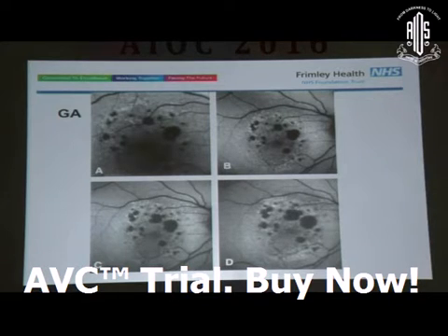We have the lampalizumab trial, the Chroma and Spectri studies, which actually depend on fundus autofluorescence to decide whether the patients are eligible. Because with the geographic atrophy trials, what you're trying to do is look at the progression and stop the progression of the disease. Similarly, you have trials using brimonidine implants, again doing the same thing. And both these trials are looking at multifocal lesions as opposed to unifocal geographic atrophy.